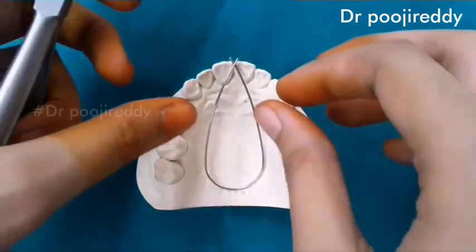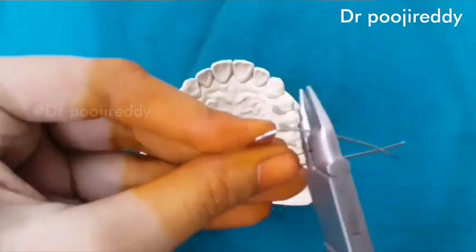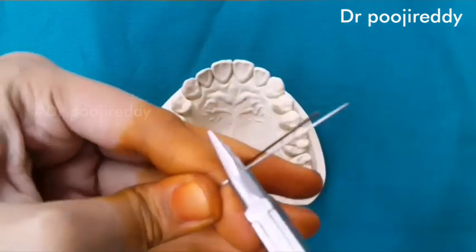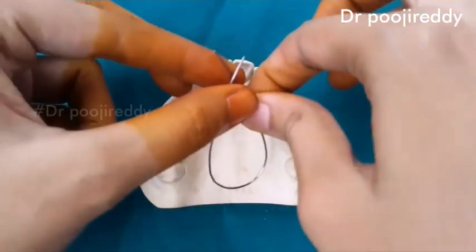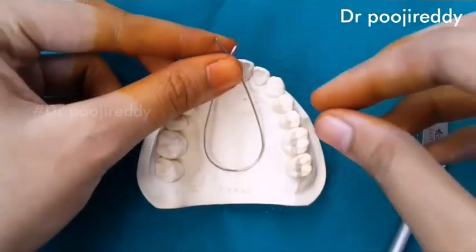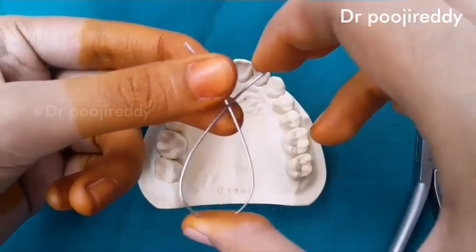Check once by placing in the cast. And then some more modifications. Coffin spring is used for the slow maxillary expansion.